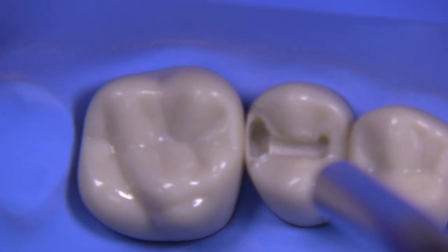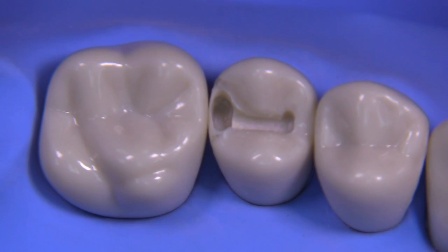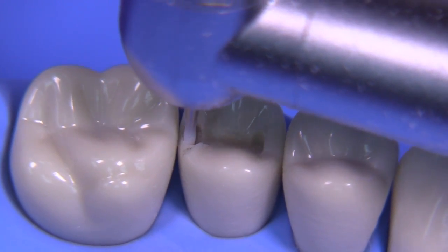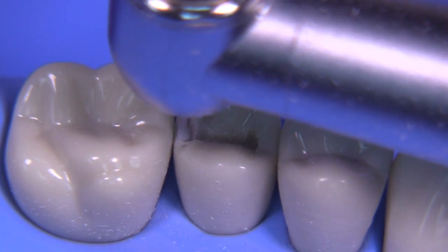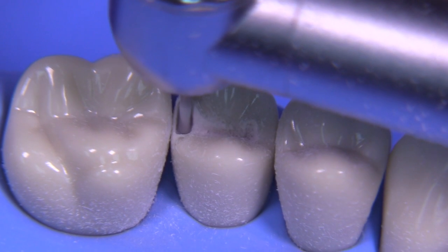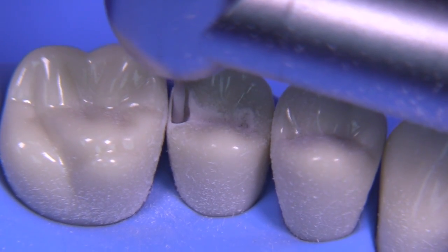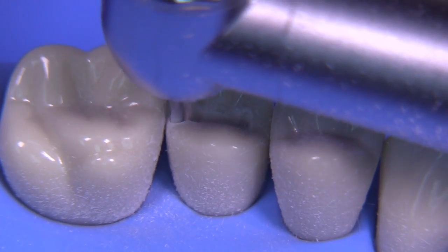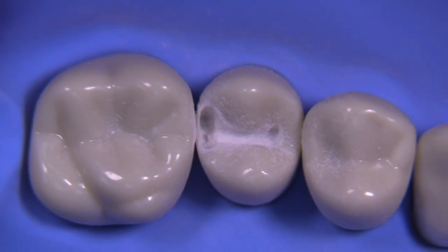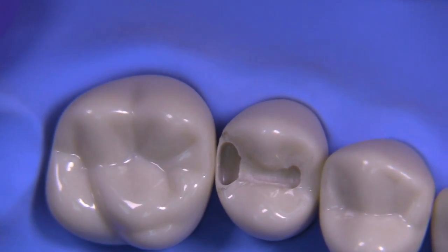Remember when we use the word depth, we're referring to a direction towards the pulp, not towards the gingiva. So when I say axial depth, I'm referring to how far you're going in towards the pulp in that box, not how far you're going towards the gingiva. Now you can see I'm starting to tip the burr just a little bit as I approach the functional cusp wall, which would be the lingual wall in this particular case. The facial wall will be nearly perpendicular relative to the gingival, where the lingual proximal wall will form an acute angle — slightly acute, probably about 85 degrees. In so doing, you will obtain the appropriate amount of proximal box clearance and enhance your retention.